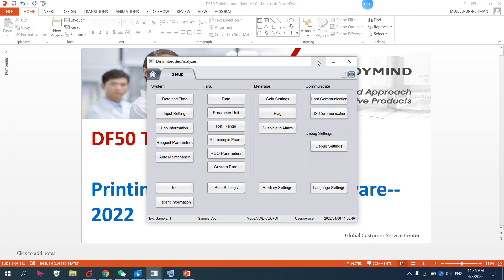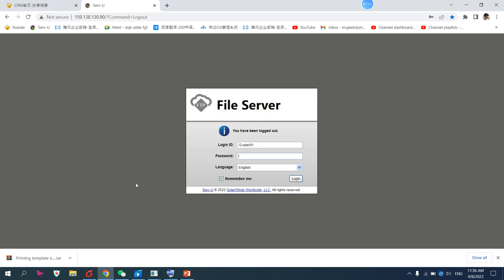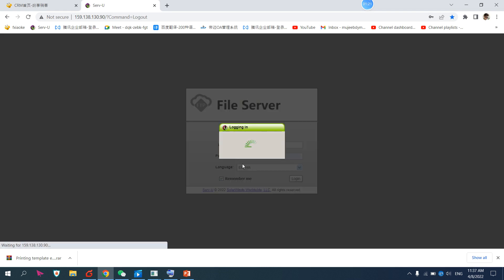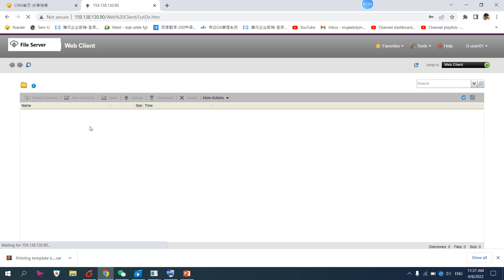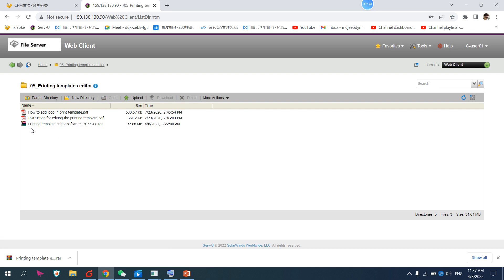Then you have to go to our FTP server and login with a general account. In the general account, you will find the software file. You have to download that software. I have already downloaded it, and also these two instruction guides.